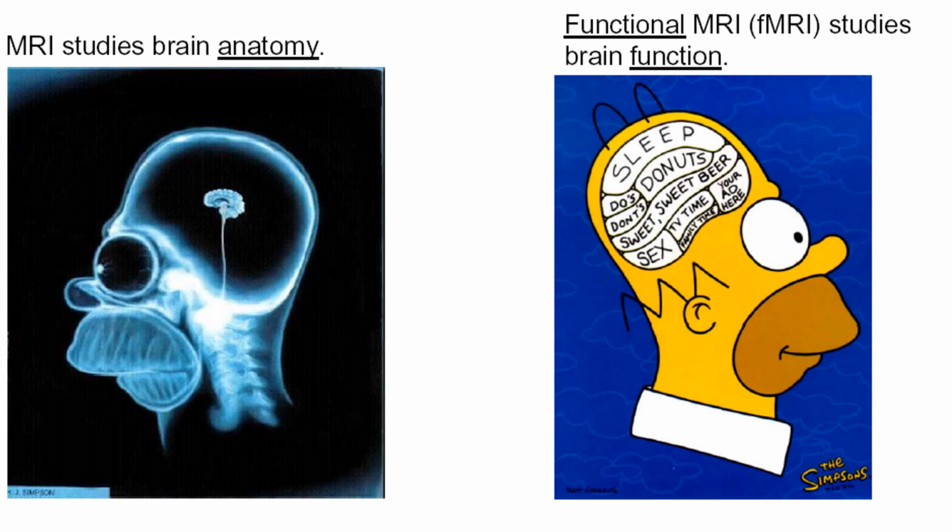Before jumping directly on functional MRI, we need to understand the difference between an MRI and an fMRI. MRI is magnetic resonance imaging, and fMRI is functional magnetic resonance imaging. They both are medical imaging techniques that use strong magnetic field and radio waves to create images of the body. However, there are some important differences between them as well. First, being the imaging purpose.